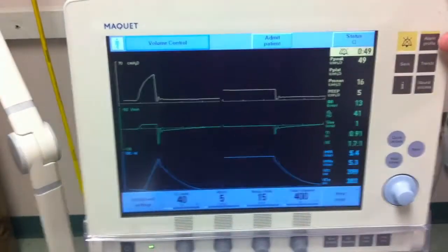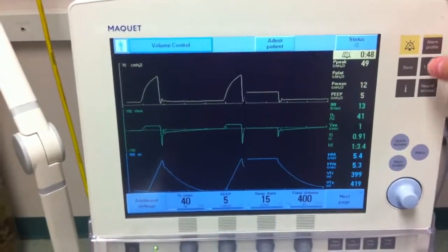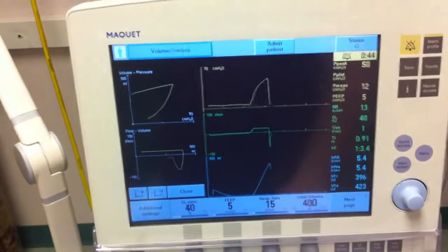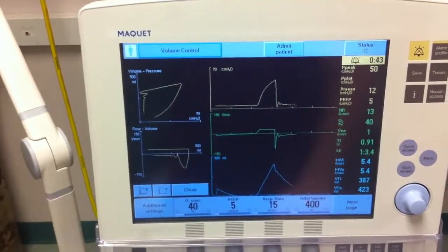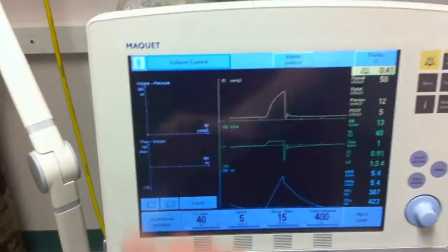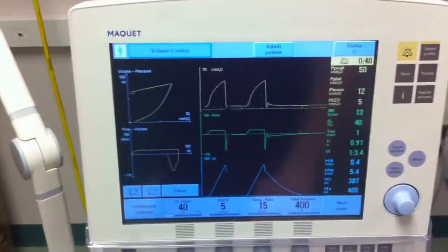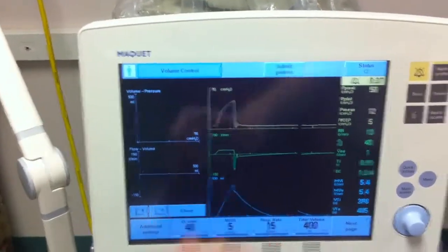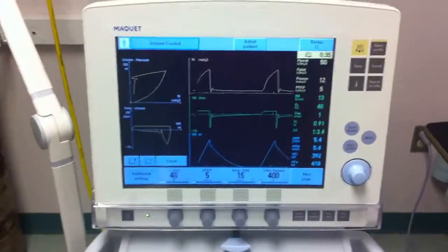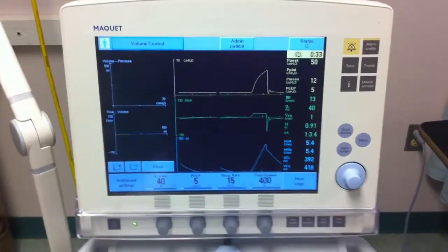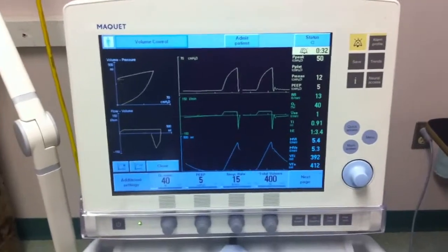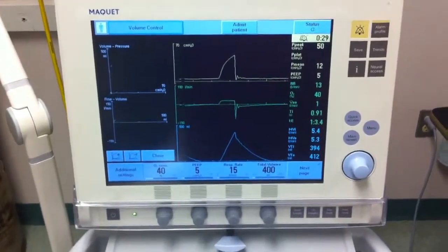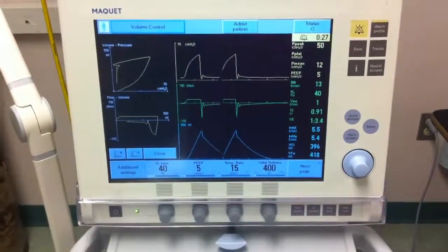After obtaining your plateau pressure, you pull the loops back up. You also notice a very prolonged expiratory phase on your flow-volume loop with an ice cream scoop type of pattern. At this time, discuss the potential problems that you see going on. We will pick the case up later. Thank you.